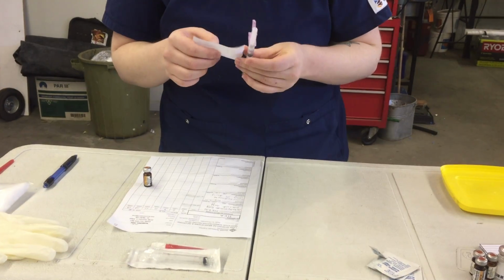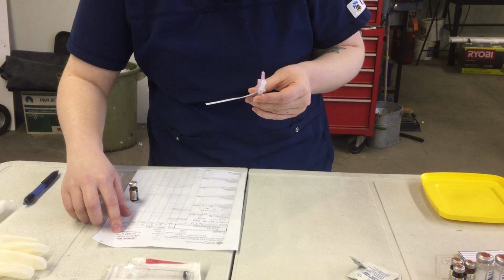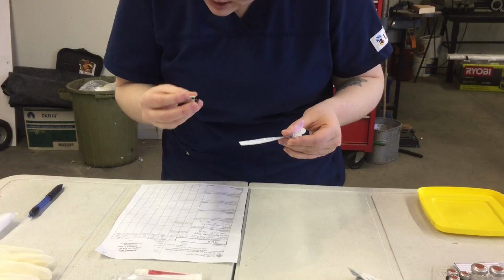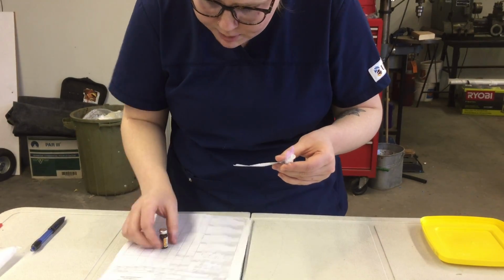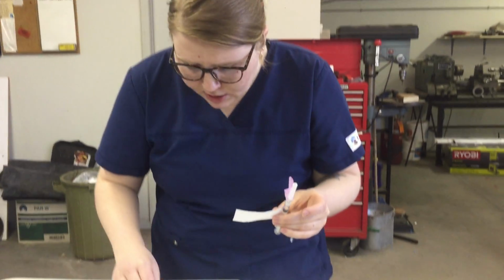So we have Jake Nursing, right patient, so January 1st, 1960, he has no known allergies. So we have metoclopramide, this is metoclopramide, so that's the right drug, 5 milligrams per ml, this is 1 ml with no bubbles, so that is correct.